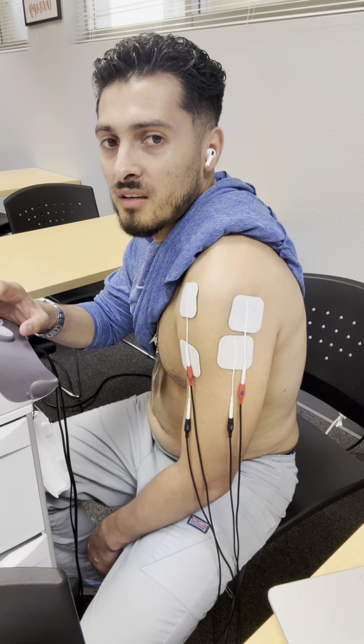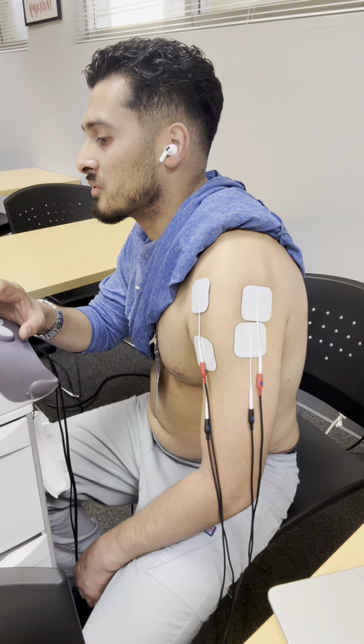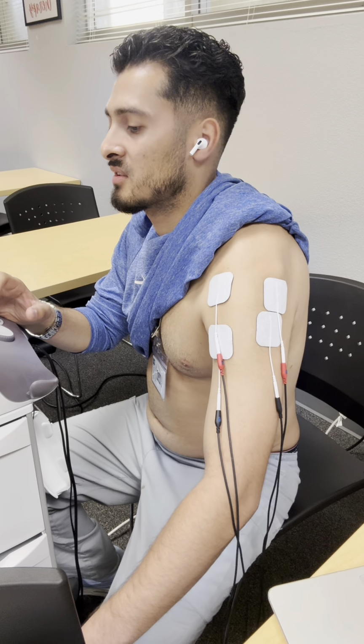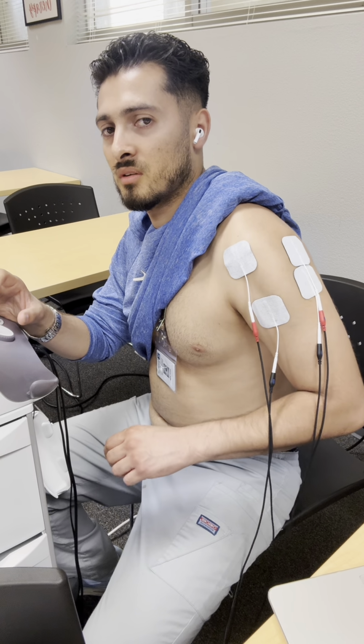Oh, look at that. Now it's ramping up, it's 11 right there. Starting to be more of an intense contraction. So now it's at 12. Starting to get more of the pins and needles sensation. There we go.